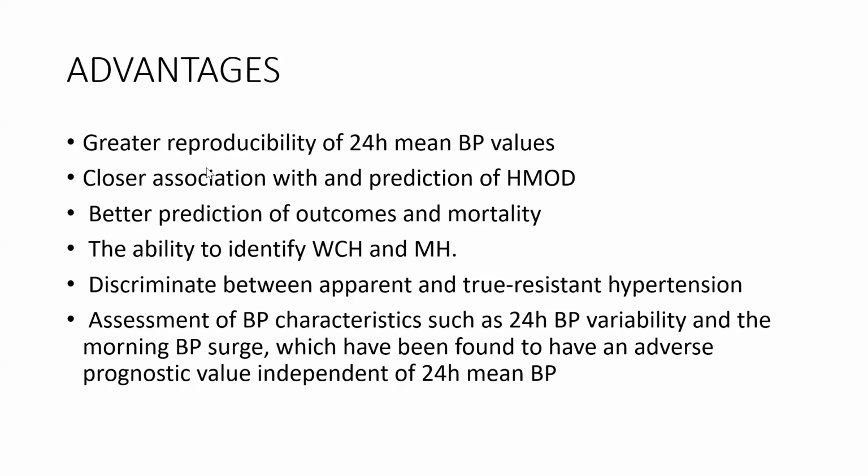Okay. So it's able to identify white coat hypertension and masked hypertension. White coat hypertension is when the blood pressure meets the threshold for diagnosing hypertension in the hospital, but not in outside-the-hospital measurement. Whereas masked hypertension is the reverse. The threshold for diagnosing hypertension is met in an out-of-hospital setting, but not in the hospital setting.